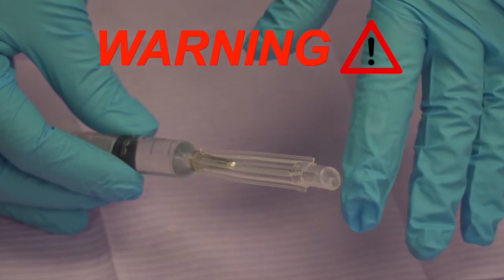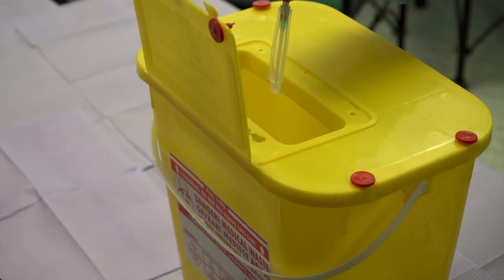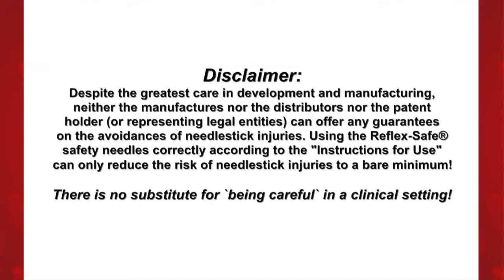Warning: Never test the safety needle's effectiveness by tapping the end cap after use. Discard immediately and appropriately after use. Disclaimer: Despite the greatest care and development in manufacturing, neither the manufacturers nor the distributors nor the patent holder — who are representing legal entities — can offer any guarantees on the avoidance of needle stick injuries. Using the Reflex Safe Safety Needles correctly according to the instructions for use can only reduce the risk of needle stick injuries to a bare minimum. There is no substitute for being careful in a clinical setting.